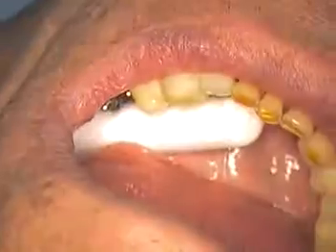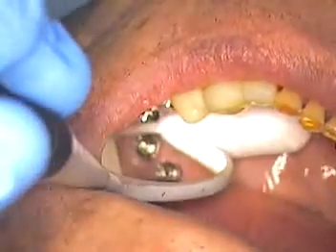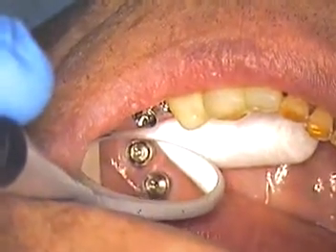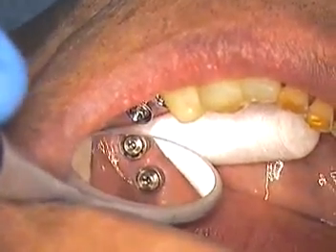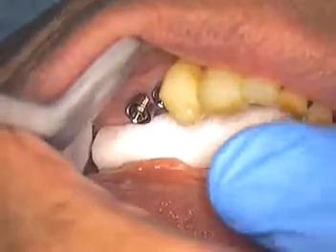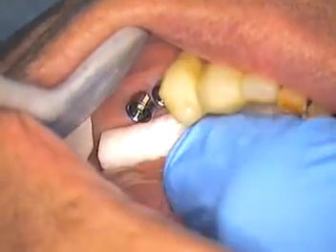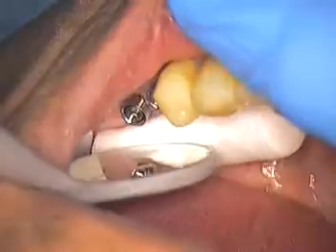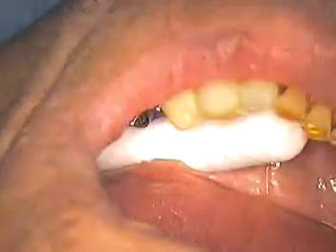Where the screws did separate was in the neck of the screw itself. So it was where the threads were probably the smallest and engaging. So that's where the trouble was.